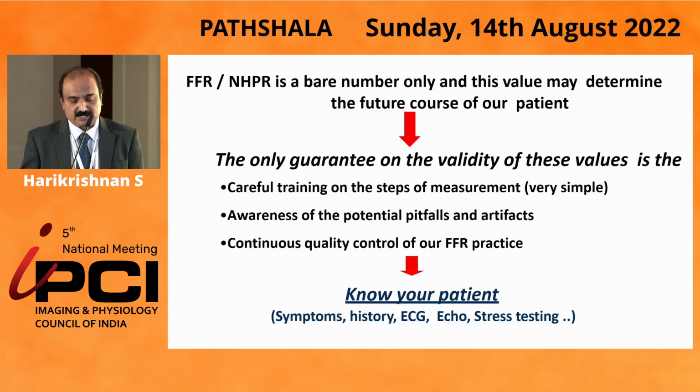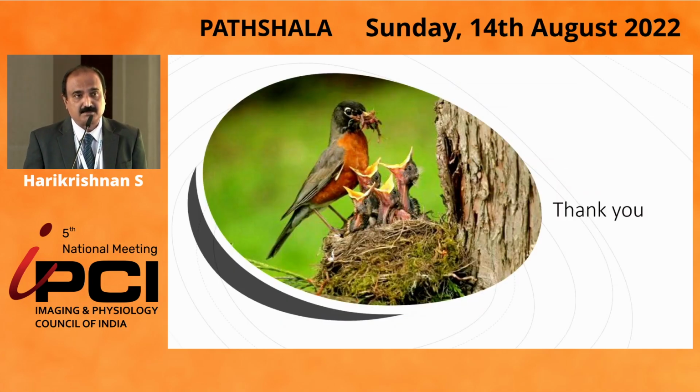Know the symptoms, history, ECG, echo, stress testing. Because if we have a gut feeling that this is likely to be significant, then you have to relook at the measurement which you have done. And always, I insist that always do a pullback after you measure, complete the measurement.